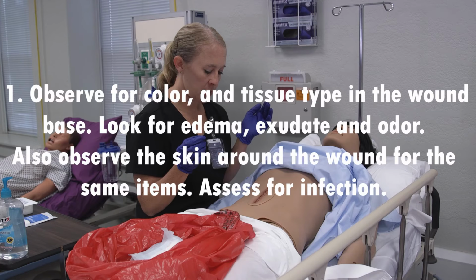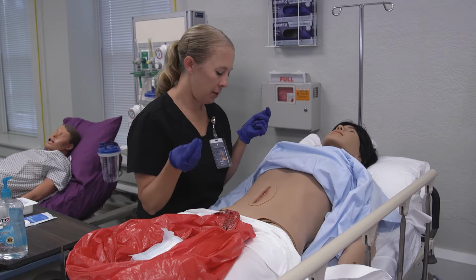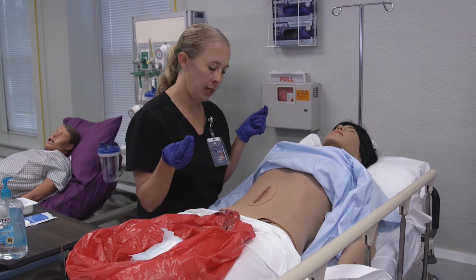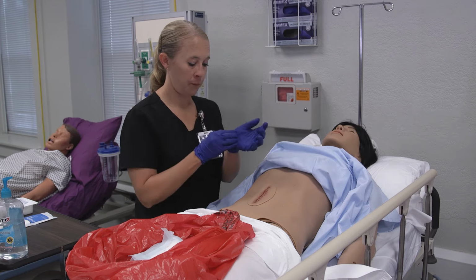Observe for color and tissue type in the wound base. Look for edema, exudate, and odor. Also observe the skin around the wound for the same items. Assess for infection. So, Ms. Wilkins, you have just a tiny bit of drainage, which is normal. I don't see any redness or swelling or anything that would indicate to us that you might have the beginnings of an infection. Remove the gloves and dispose of them properly in the trash or biohazard bag. Perform hand hygiene.